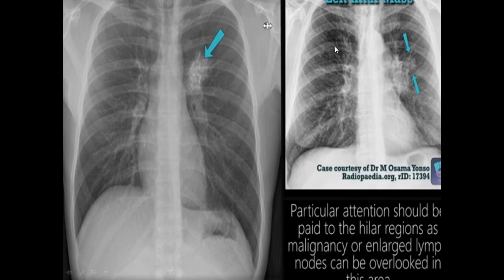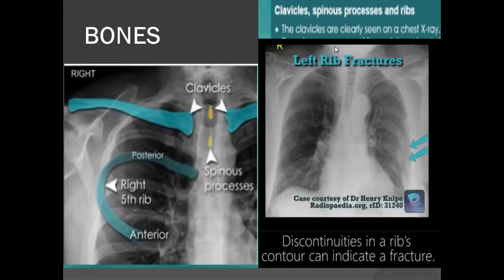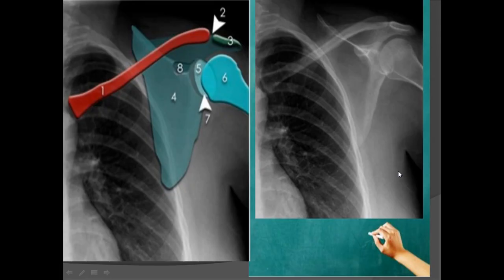When reading a chest X-ray, don't forget the bones. Always look at the bones — the right clavicle, the rotation, the distance between the spinous process and the medial end of the clavicle, the posterior ribs, anterior ribs, and the scapulae. Here there are discontinuities and multiple fractures of the left ribs.